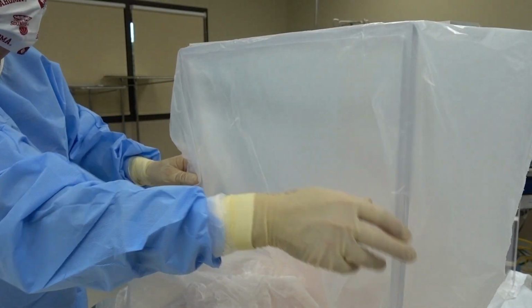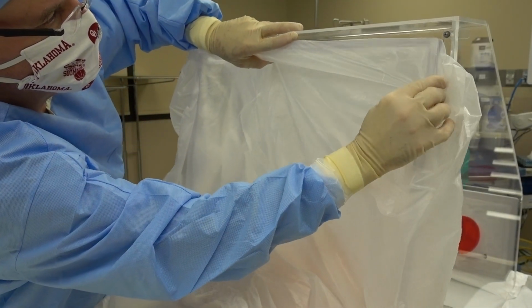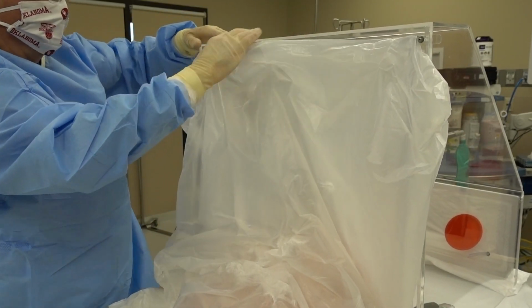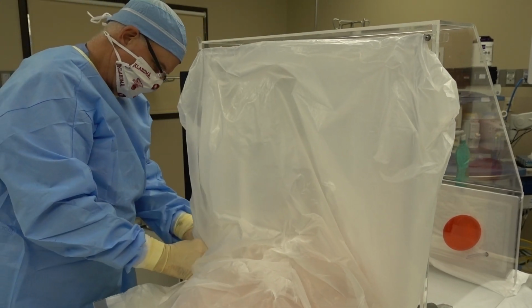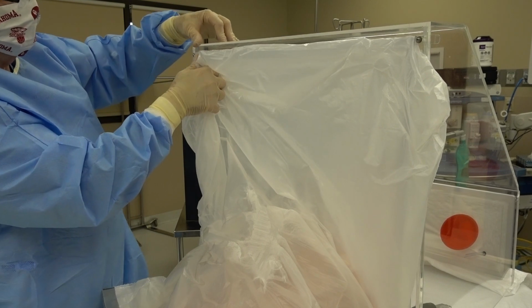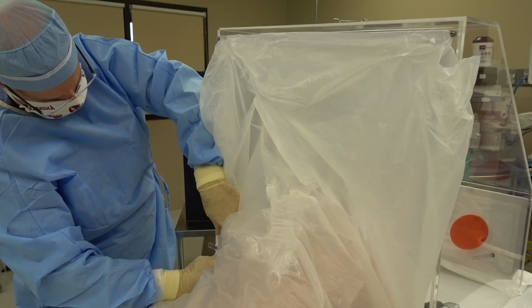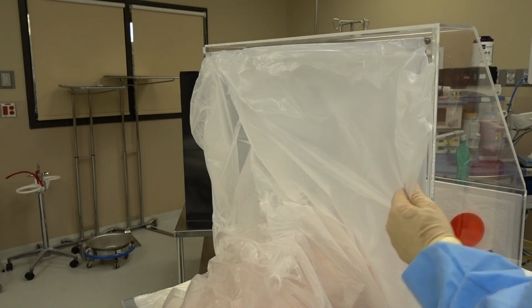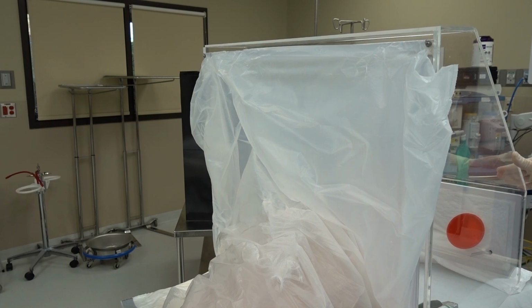And again, this will be on here before it's placed over the patient. So that ring just drops in right in that mitered groove, if I can see it. Just like that. And those tabs are closed, just like on the other side, if I can get it in there. It drops right in when it's off the patient and having been used 100 times. But that's all you do to load that one. So again, you want it flush. You want the ring flush in there. Push it in and just put your tab down.